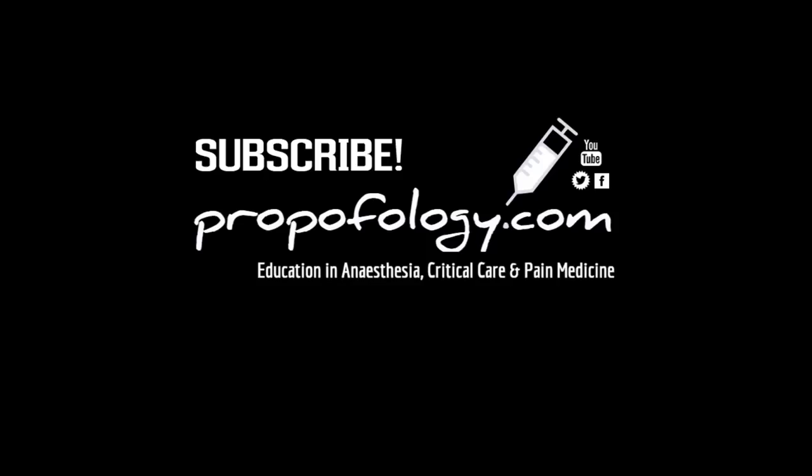As I've already said, we're going to do more videos on chest X-ray interpretation, in particular the pathologies one might find in patients in critical care or emergency medicine.